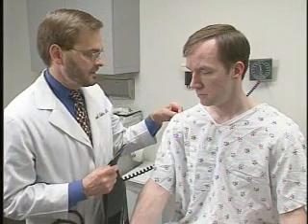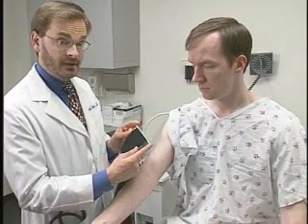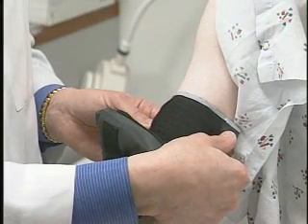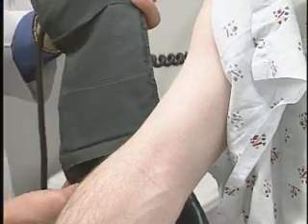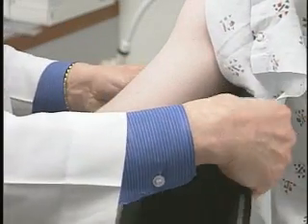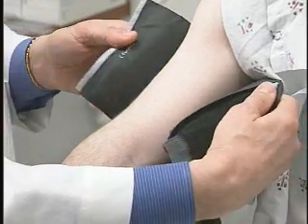To determine which cuff is appropriate, we need to measure 2 different variables on the arm. We measure the width of the blood pressure cuff against the patient's arm. The width of the blood pressure cuff should be approximately 40% of the circumference of the arm. Also, determining the total length of the bladder of the blood pressure cuff, which is where the tubes come out of the blood pressure cuff.